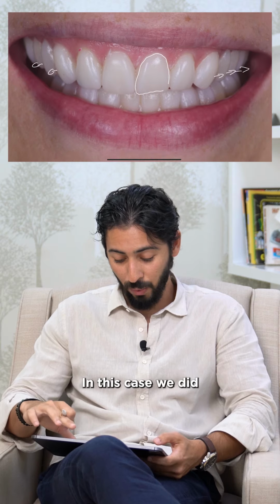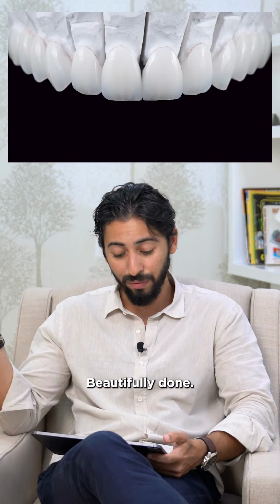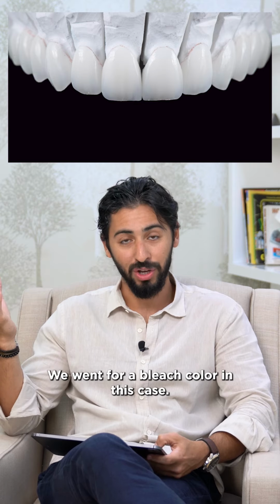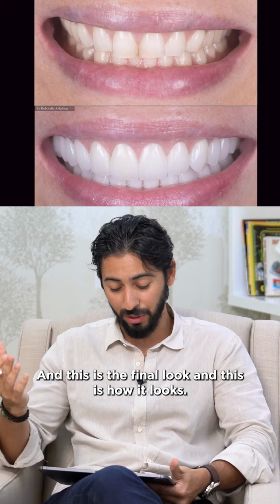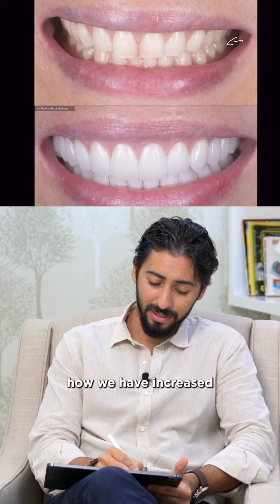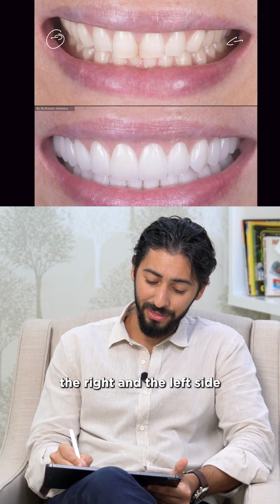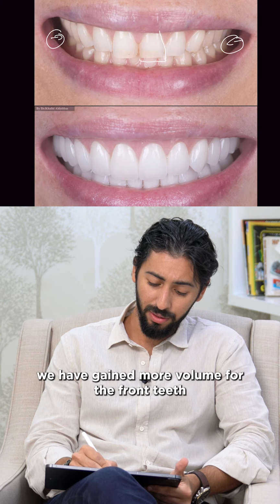In this case, we did full feldspathic veneers. These are the feldspathic veneers for the upper teeth, beautifully done. We went for a bleach color in this case. And this is the final look. We can see very clearly how we have increased the right and the left side. We have gained more volume for the front teeth. You can see over here, in comparison to the bottom picture.